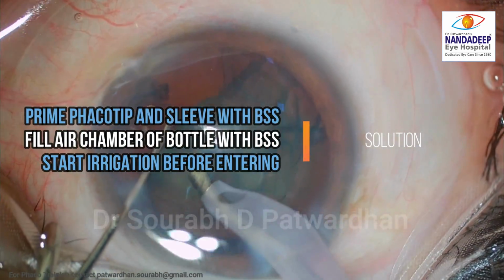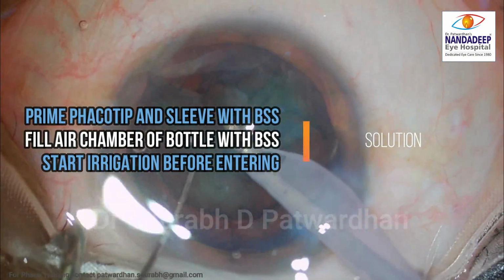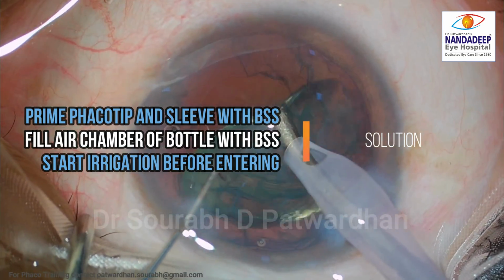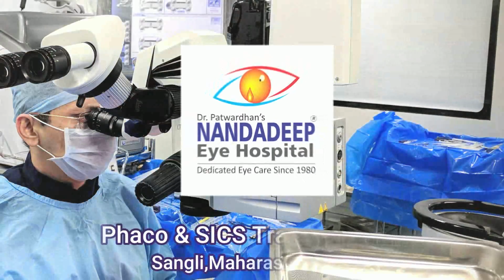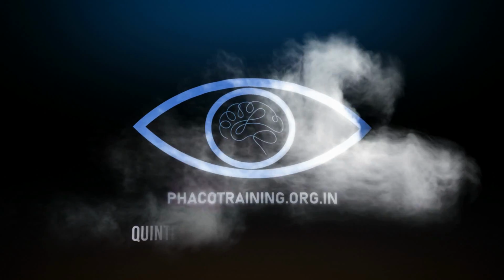So it is important to prime the phaco tip and sleeve with BSS. Apart from that, we must fill the chamber of the bottle with BSS or the irrigation line, and the irrigation should be started before entering the anterior chamber to avoid any air coming in. So it is important to check the entire irrigation line before we start to avoid this trouble.